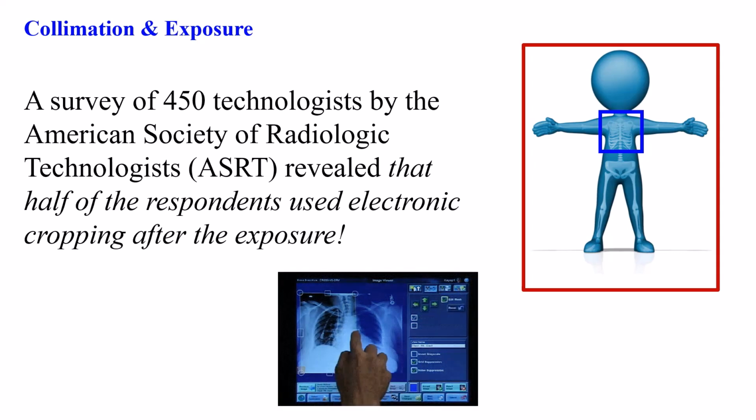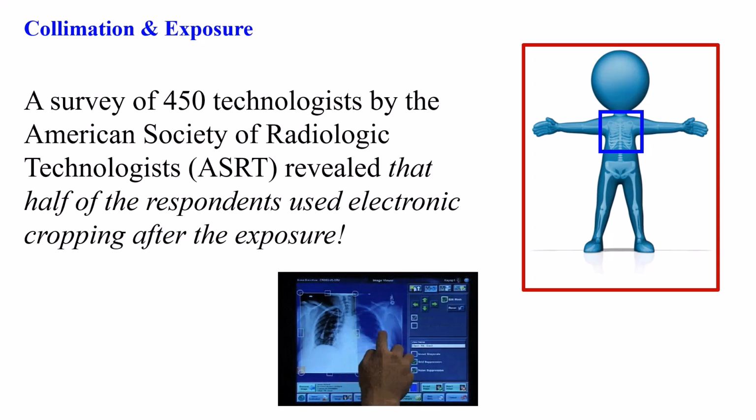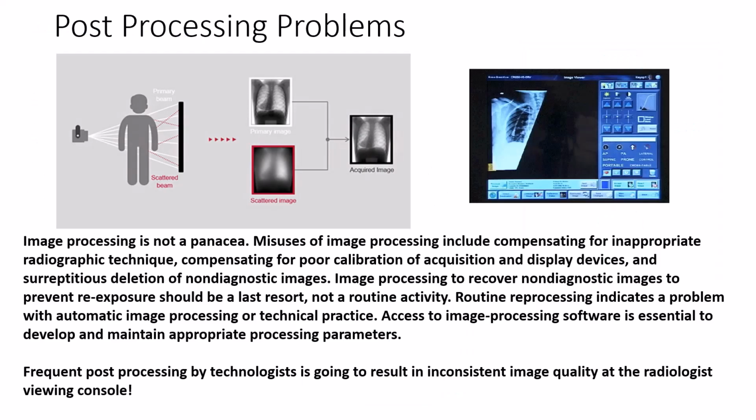The problems with this misconception is that they were over-irradiating the patients, the images were degraded, and the radiologist only saw the area that was masked off and therefore could miss pathology that was acquired on the original image.